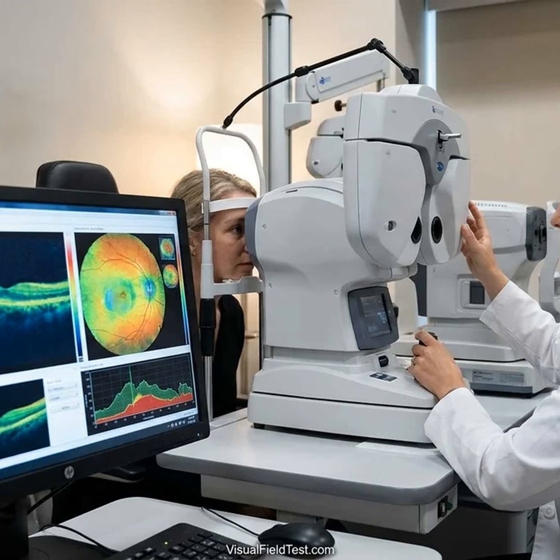Decentration. The scan must be centered on the optic nerve or macula. If the circular scan around the nerve is even slightly off-center, one sector can falsely look thin or thick. OCT software will usually warn if the scan is not centered. In practice, techs carefully align the scan and the doctor reviews the cross-sectional B-scan images to confirm.